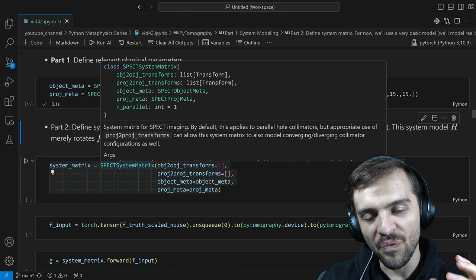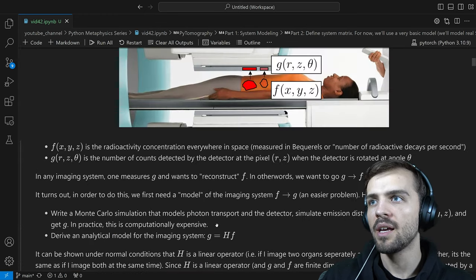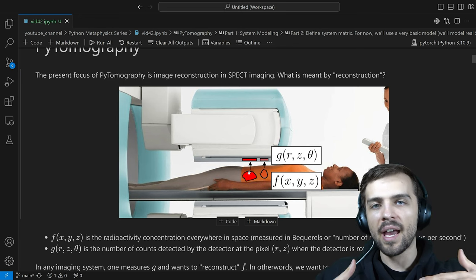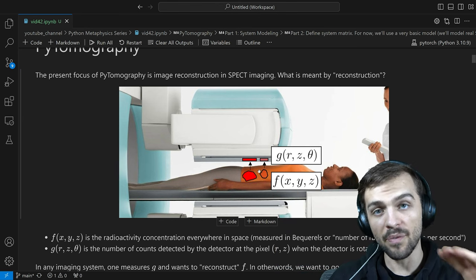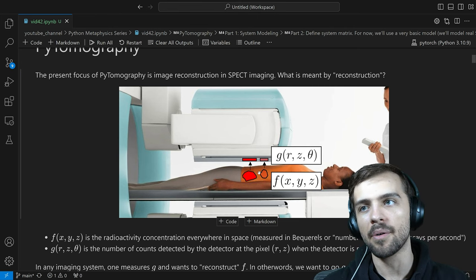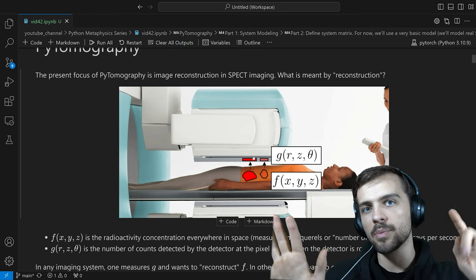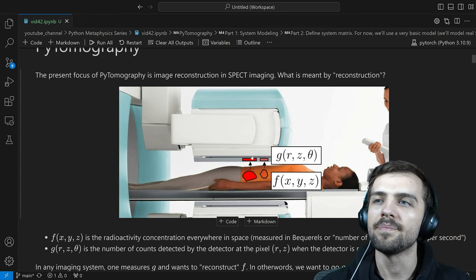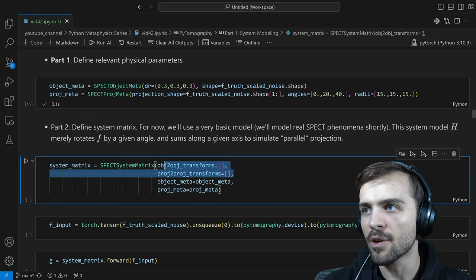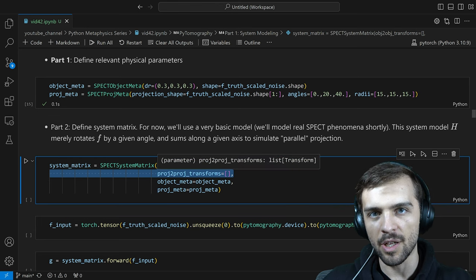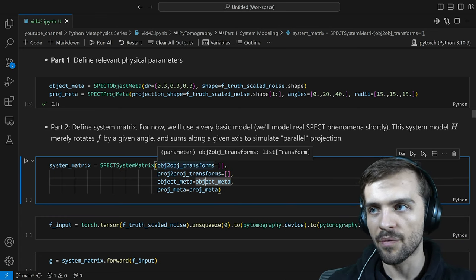We're looking at three different angles and corresponding radii. Before getting into sophisticated modeling of the system matrix, we'll use a very basic model: photons just travel perpendicular to the detector and get detected. So you're essentially taking a projection of the 3D patient. That's a very basic model and inaccurate, but it's a good way to think about what's happening with the SPECT system before we get into details. These empty list arguments will be filled with things later as we derive an analytical model for the physical phenomena in the SPECT detector.